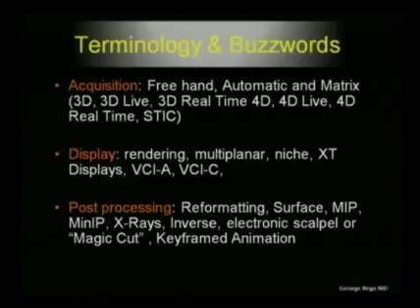In the display modes, the most used one is the multiplanar display, but in the meantime, there are extended displays or image displays that simulate a CT or MR that are increasingly being used in everyday practice. But as a matter of fact, the multiplanar display and the rendered display are the most commonly used ones.